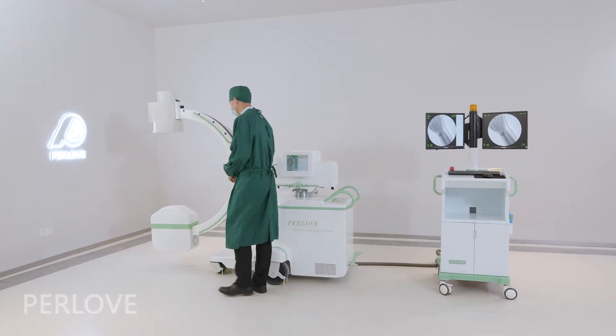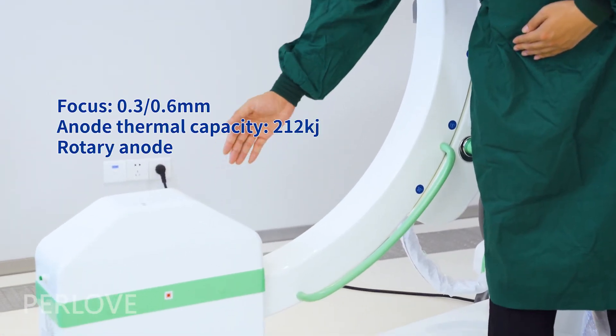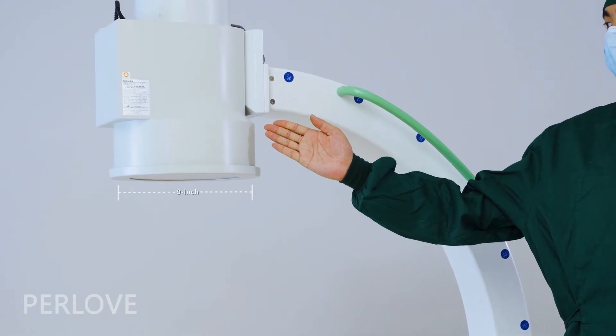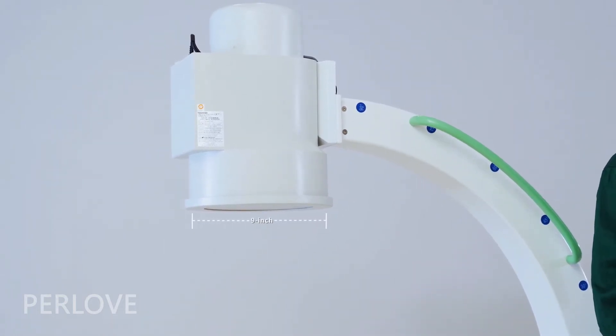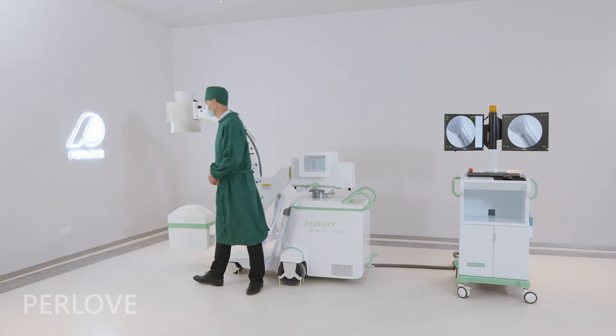With the integrated X-ray tube and generator monoblock design, we can provide high quality of X-ray source. This machine is equipped with a Canon 9-inch image intensifier with 3-view and million pixel digital imaging system to ensure the excellent quality of image.